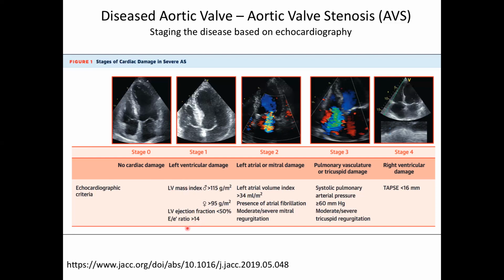So these are all physiology measurements, but they're made on imaging features, okay? It's the precision of measuring the velocity with Doppler, right? It's the precision of defining where the mitral valve plane is and how it moves over time, right? So that's all the engineering stuff, when you're building your scanner, you're trying to build a phantom to test how accurately can I tell you that this velocity is moving. And then it all boils down to coming up with some kind of physiology measurement in a person.